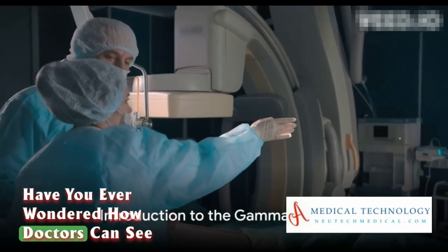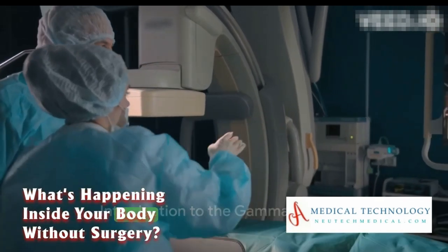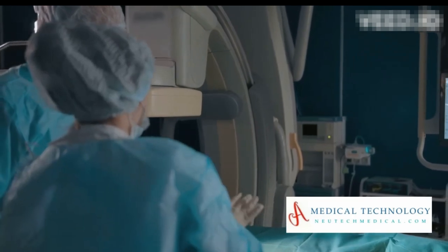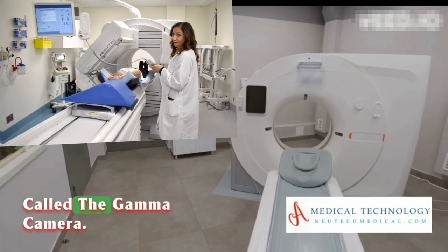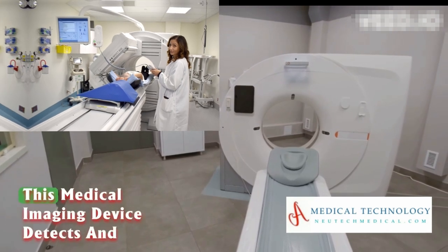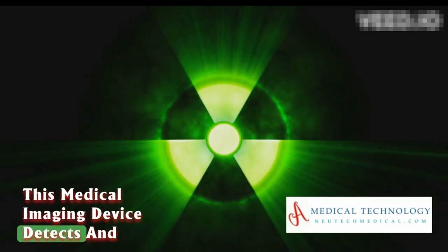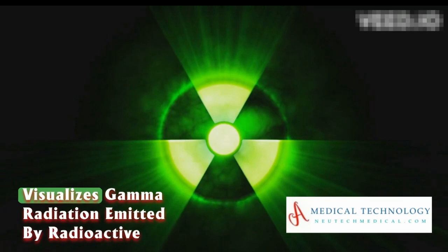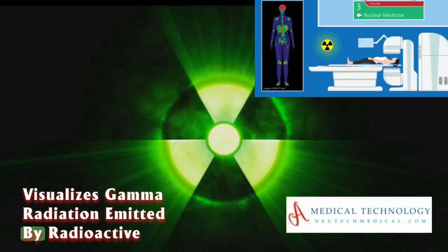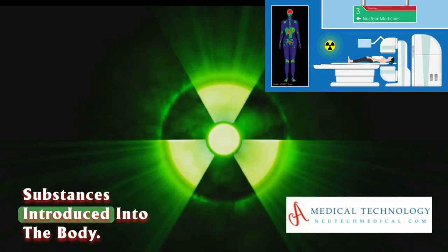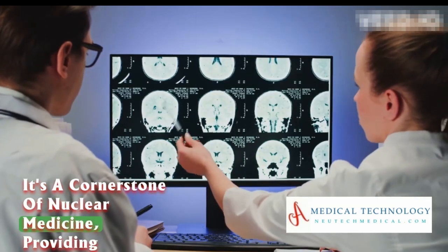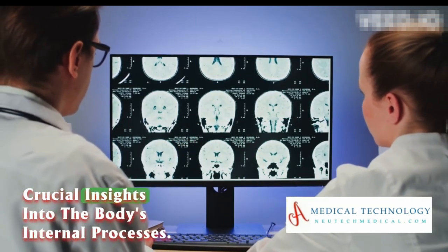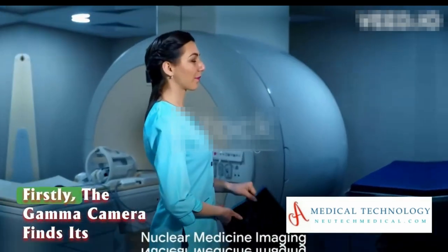Have you ever wondered how doctors can see what's happening inside your body without surgery? The answer lies in a remarkable piece of technology called the gamma camera. This medical imaging device detects and visualizes gamma radiation emitted by radioactive substances introduced into the body. It's a cornerstone of nuclear medicine, providing crucial insights into the body's internal processes.